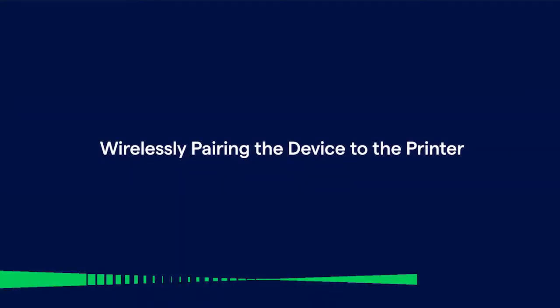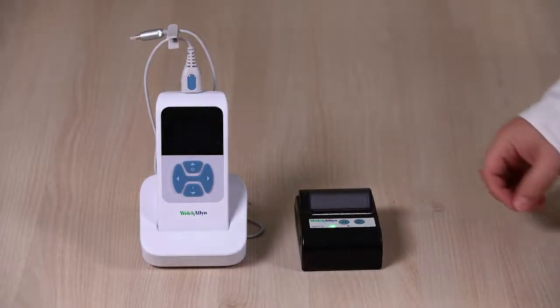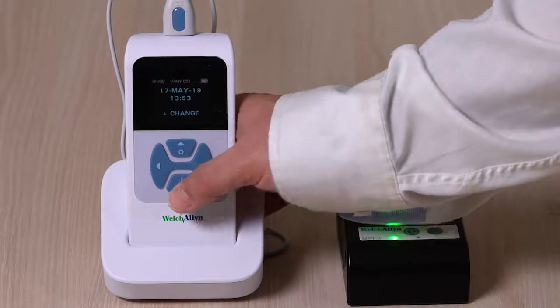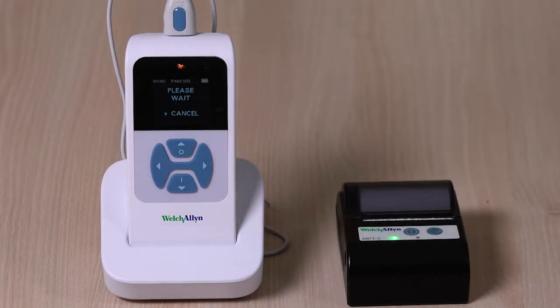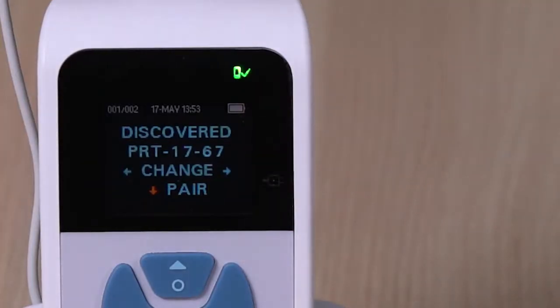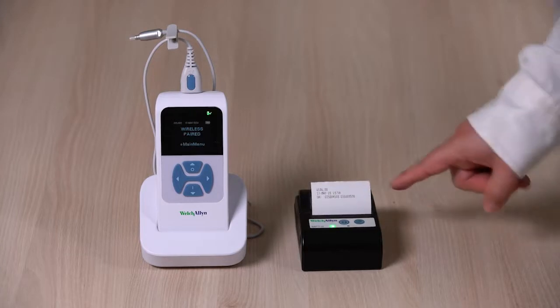Wirelessly pairing the screener to the printer: the wireless pairing menu enables you to pair the screener with a wireless device, such as the MPT2 thermal printer, for printing test results. To pair your OAE screener with the thermal printer, turn on both the screener and the printer. Navigate the screener to the wireless device menu and press the left or right control panel button to initiate discovery of available wireless devices. The screener searches for available wireless devices for approximately 15 seconds, during which the message 'please wait' appears on screen and the yellow LED light flashes. A device beginning with PRT should appear in the list of devices. Press the down control panel button to pair the screener and printer. The printer confirms pairing by initiating a print-on.